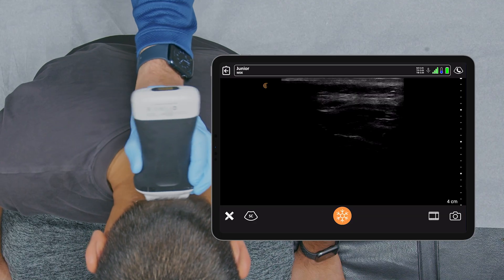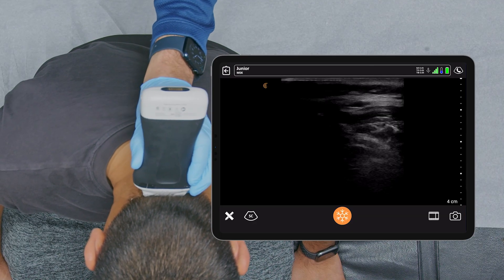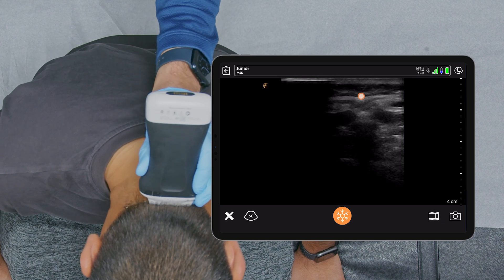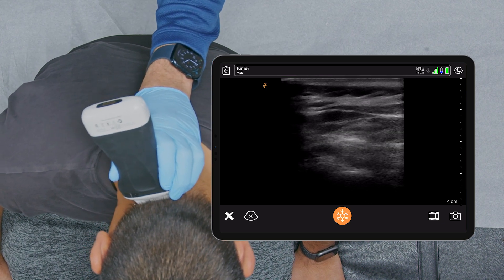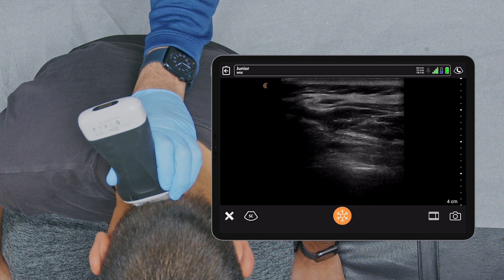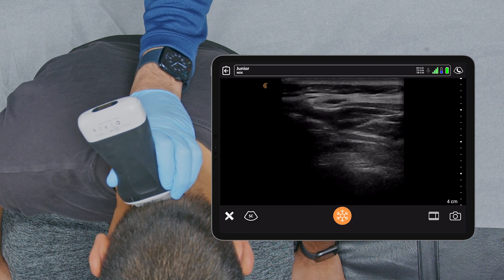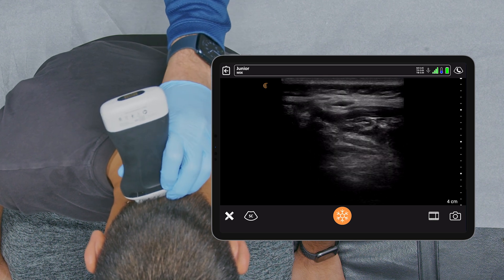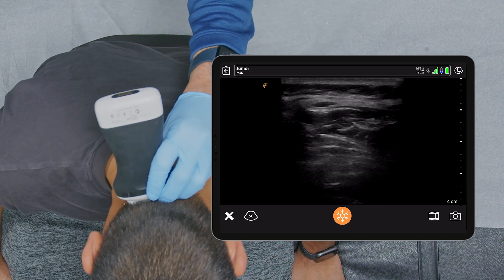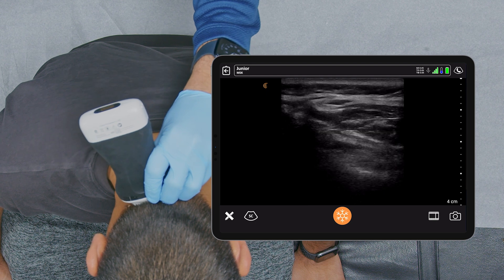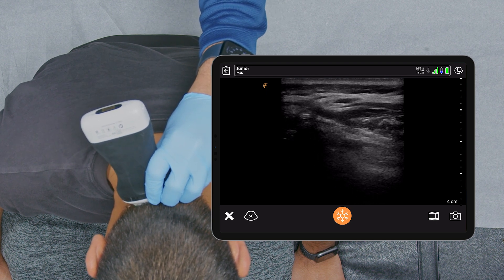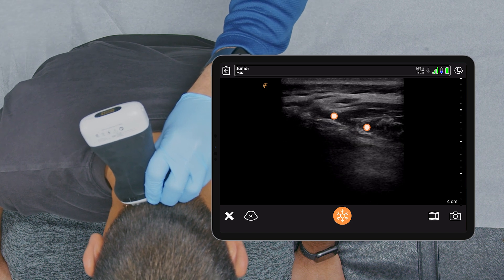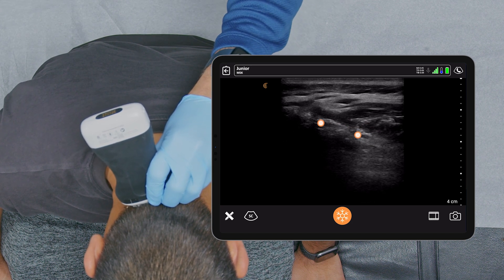I'm going to scan at the level of C2, looking for the occipital nerve. The spinous process is central over here. I'm going to scan laterally, and you can see the planes of the obliquus capitis inferior muscle and the semispinalis muscle right here. I'll angle my probe a little bit to try to get the ideal location, then target the nerve in that plane. Sometimes it doesn't look like just one nerve — it could appear as multiple nerves because they can converge in this area.